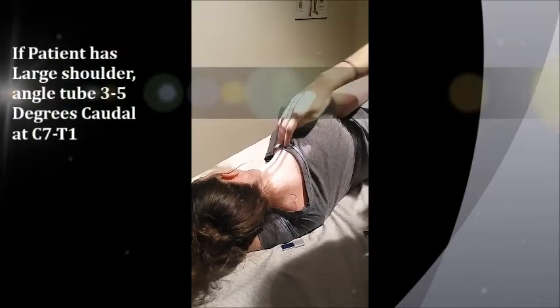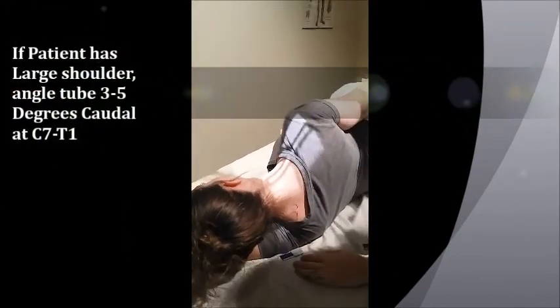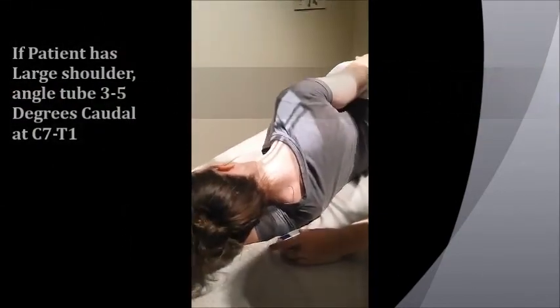If she can't depress the shoulder down, you'll use a three to five degree caudal angle toward her shoulder — it's a really tiny angle — just to help get between her two shoulders. You center right at that same junction of the shoulder and neck. For breathing on this one, she's just going to stop breathing — no expiration required.